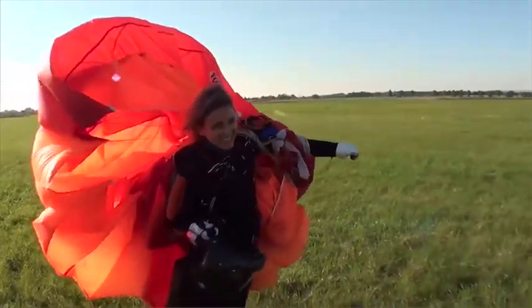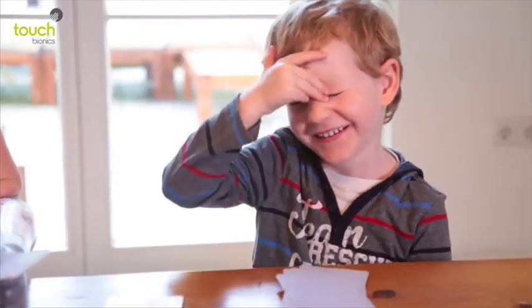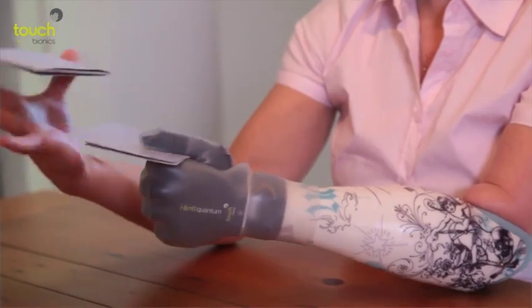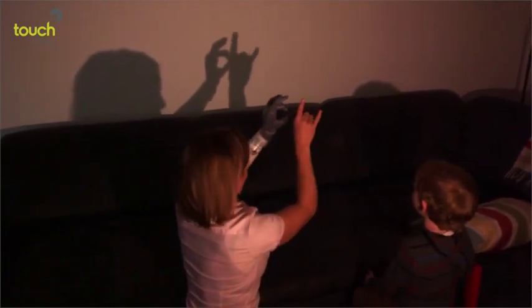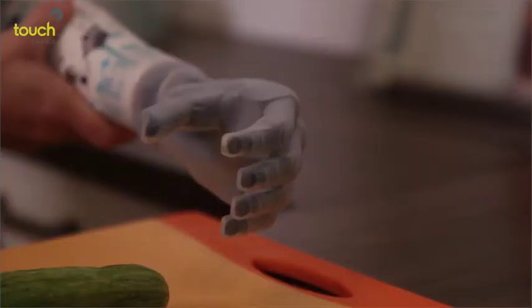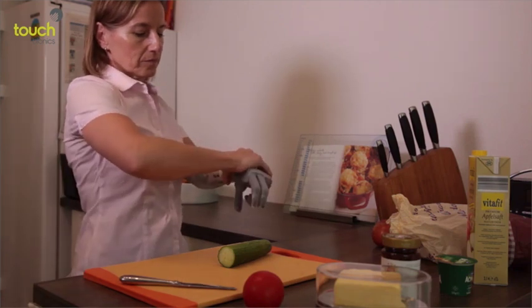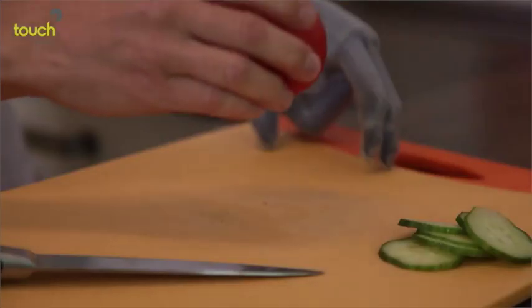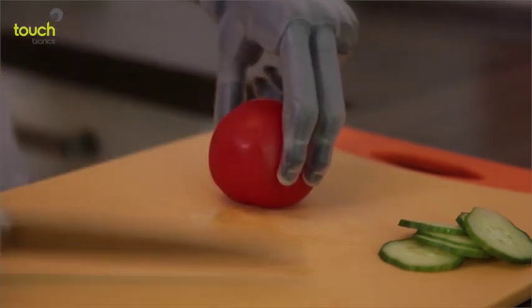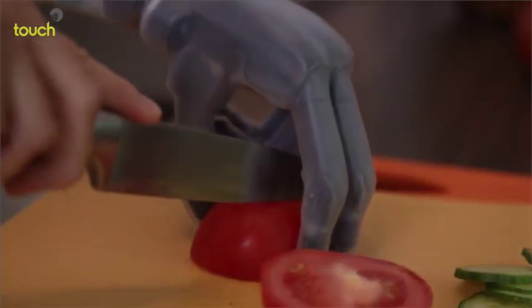So she obviously lives a very active life. We don't start off people jumping out of planes with prosthetic hands. But what you're going to see in this video is her using all the advanced features that a hand can do. She's going to show you what's possible with the hand. In this first demonstration, she's going to use gesture control, which means she sustains an open signal and then just moves the hand slightly to get into a grip. She could certainly perform a task like cutting this cucumber without being in a mode or a grip or a feature, but it's going to make it a lot easier to perform a task, just like you and I would, curl some fingers underneath to get them out of the way when you're working with a smaller object.